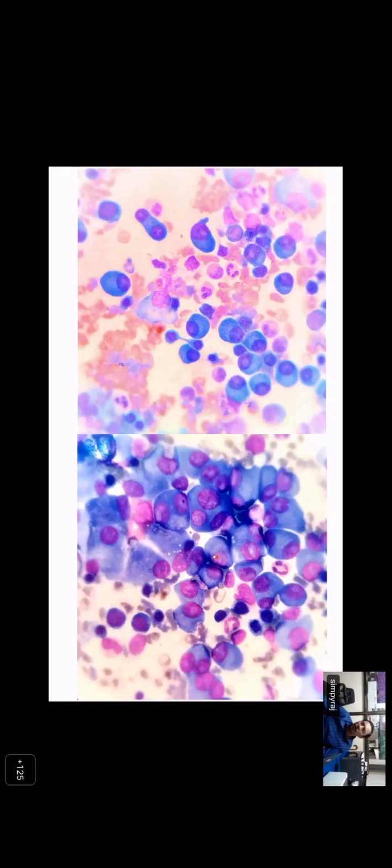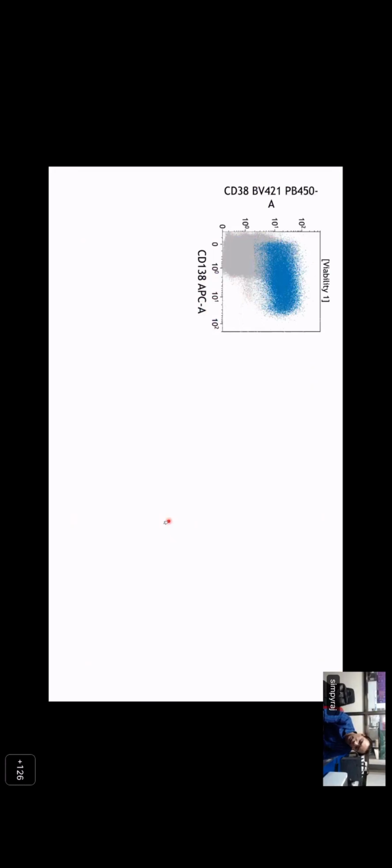And there are multinucleated plasma cells, as Deepika said very rightly. This indicates neoplastic proliferation, because plasmablastic morphology is not seen in normal plasma cells. Although sometimes in reactive conditions, you can see some binucleated plasma cells, so that is not a feature of neoplasm. But so many binucleated plasma cells, multinucleated plasma cells, and prominent nucleoli suggest neoplasm. Okay, then the patient's flow cytometric immunophenotyping was done.